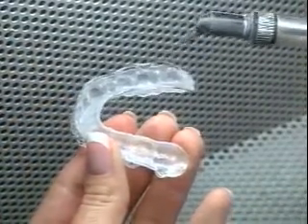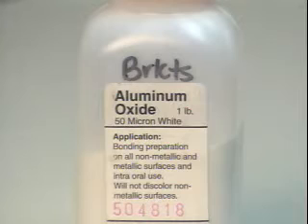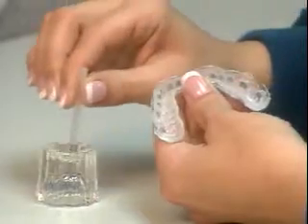Micro etch the dry custom resin base to roughen it. Do not abrade the resin. 50 micron aluminum oxide is used. Do not use 90 micron as it will abrade the custom resin base. Apply acetone to the micro-etched base to clean it and let it air dry.